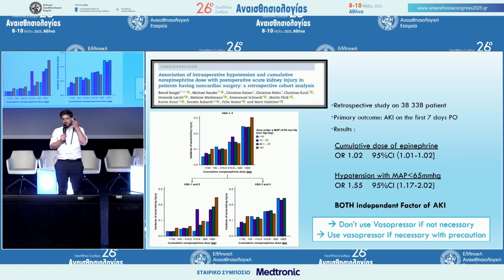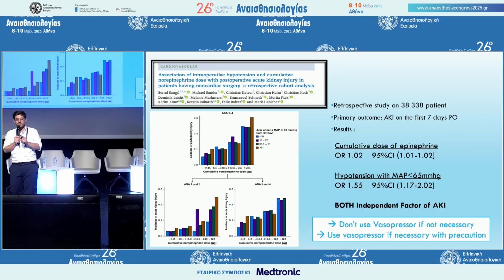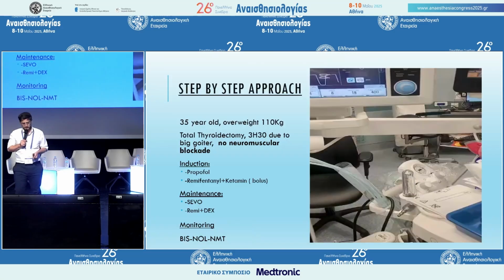So it's really, really important to me to think about the target organ and to adapt the monitor to this. Is there a doubt? We can use the NOL monitor, we can treat the patient, but first to think, we can treat the person by not being iatrogenic, not giving more than necessary drug to the patient. So this is my third video.